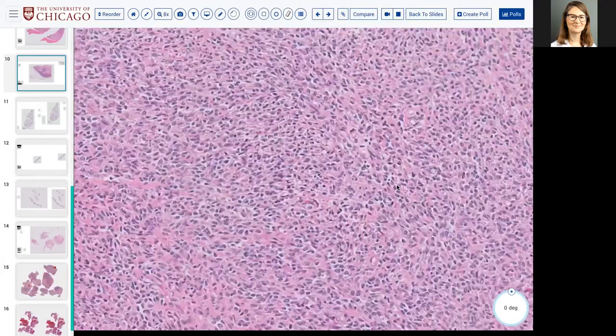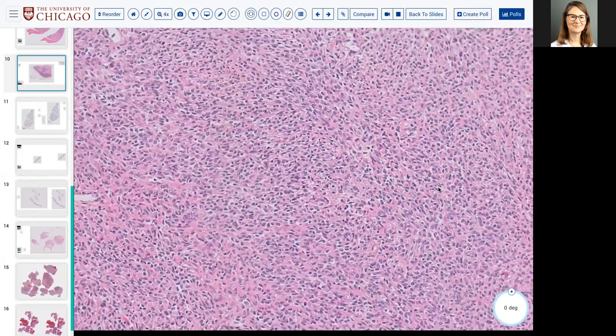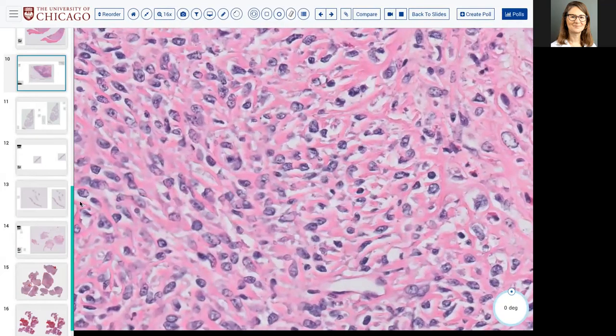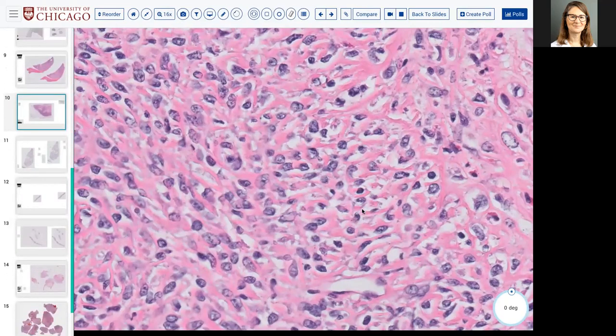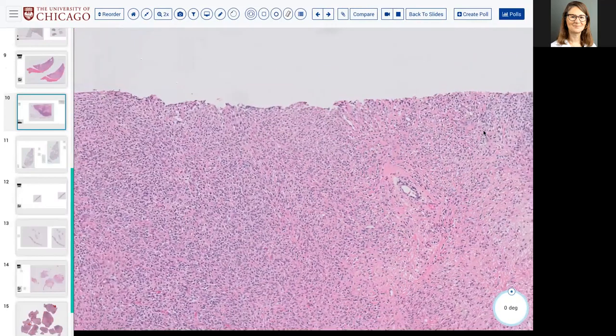And we're lucky today to see this on a giant histologic resection section, but you may be dealing with these diagnoses on biopsy. And I know I try to give you guys biopsies, but sometimes they're just not available, but we do have some coming for the last few cases. So I apologize for that. But this is a gorgeous example of a tumor.